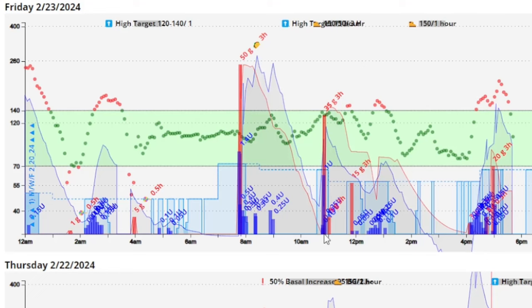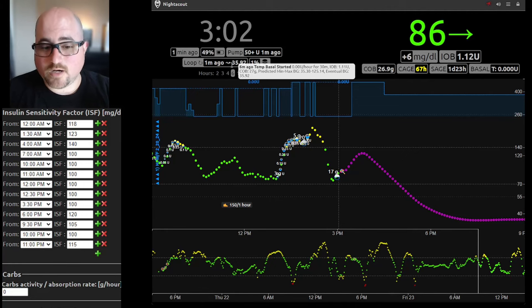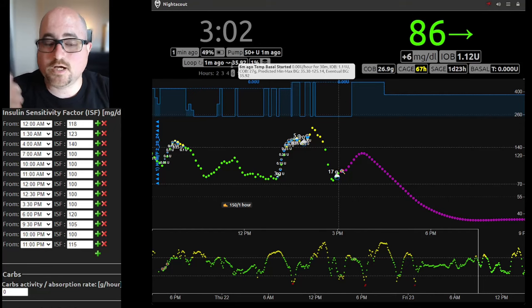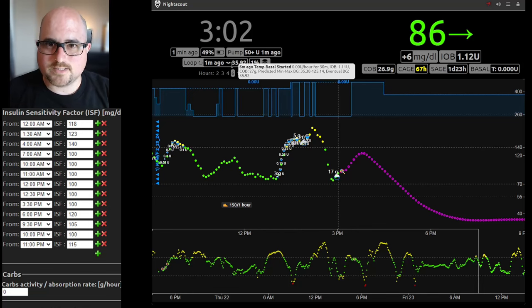So if Loop were to recalculate, you may see that breakfast — 50 grams — absorbed in two and a half hours. If you change the ISF from 100 to 150 during this timeframe, it will go much longer — instead of two and a half hours, it might say three and a half or four hours. And that's retroactive. So that red line will start to overlap with the lunch or snack entry. More of those carbs that were seen as part of the snack will also be pushed out because the meals are overlapping each other. Then the next one pushes out, and the next one pushes out. So it potentially increases how carbs are seen to where all of a sudden you're dealing with more active carbs than expected. Loop shows 27 carbs on board right now — if you increase the ISF to 150, his carbs on board might jump up to around 40, so now Loop wants to dose for another 13 carbs. That's why he might go low — the meals appear longer.